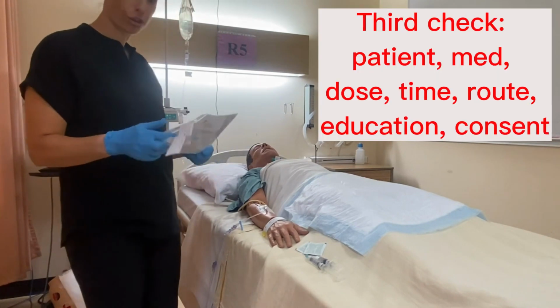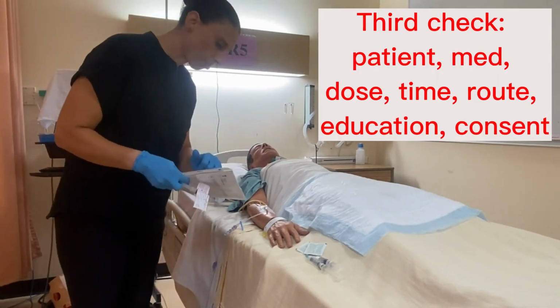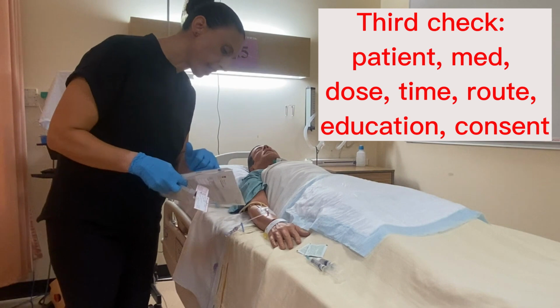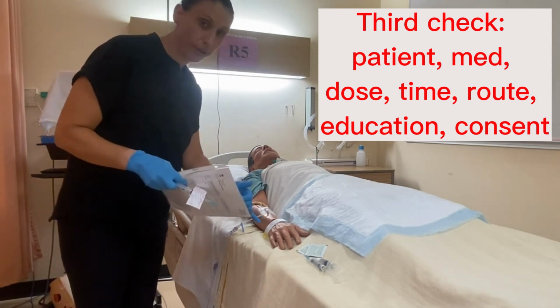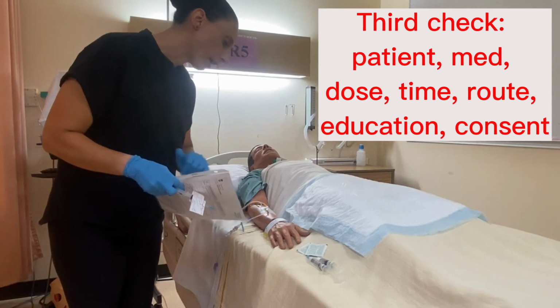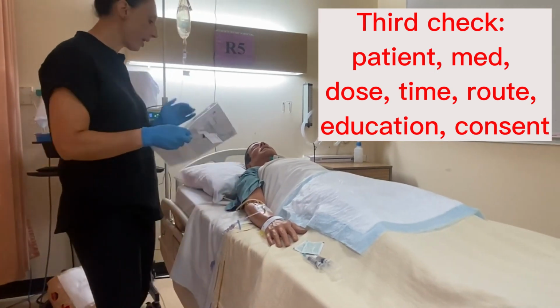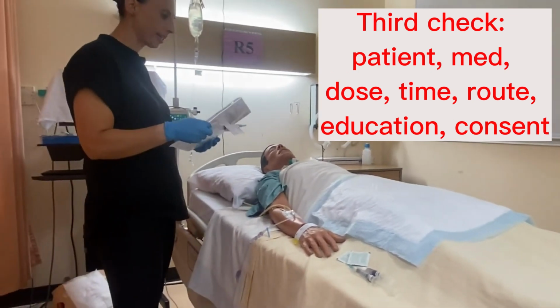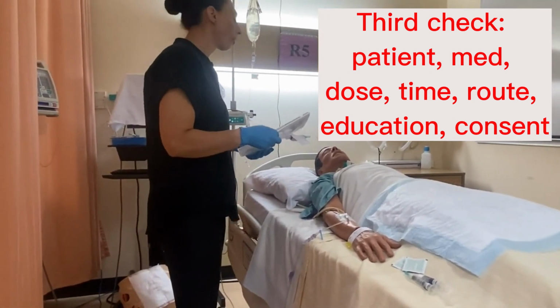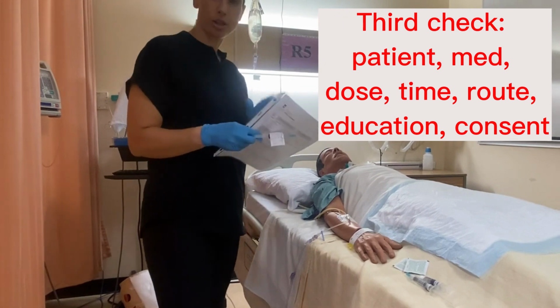I'm now going to do my third check. So I'm going to check the patient's name, and then also one other identifier, either the date of birth or the MRN or FIN number, and compare it to the patient's name band. I can also ask the patient as well, can you state your name for me? Perfect. Can you tell me your date of birth? Perfect, thank you very much. That matches my records.